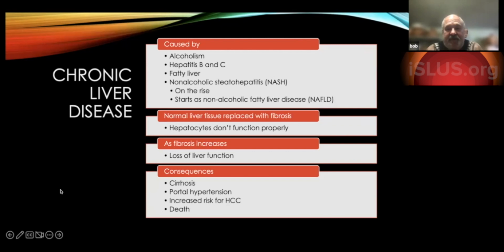So that's important to understand what's going on, where these values are coming from, and what's affecting them. The stiffness and the attenuative properties of the liver are what's going to help us determine the degree of disease process in that liver.